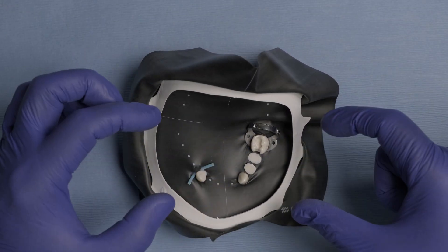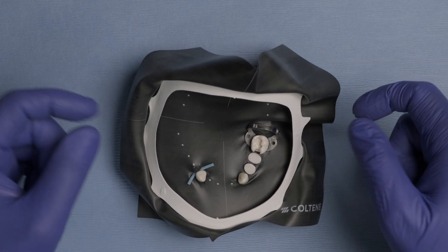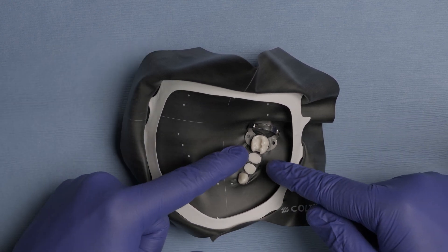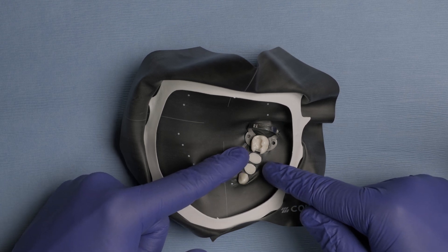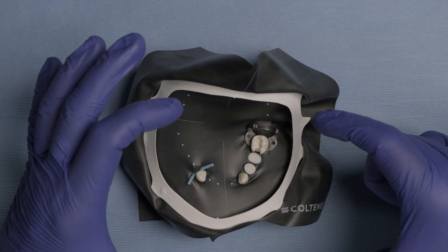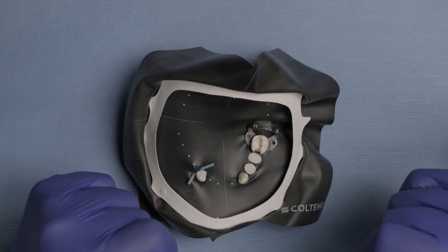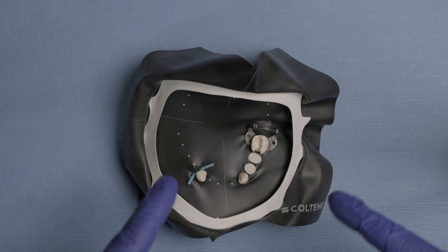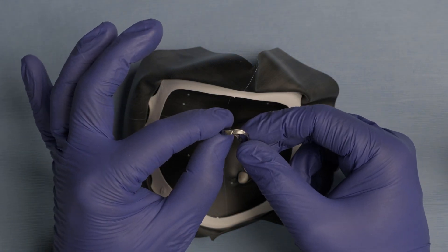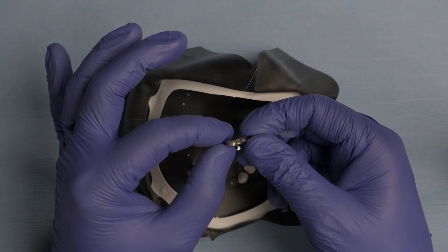We have our operative area correctly isolated using the isolate black rubber dam, a W3 clamp, and a wedget. Even though tooth number 20 and 21 are literally broken down to the gingival margin, this latex rubber dam has so much retraction potential that I was able, without an additional clamp, to isolate both teeth. However, I still need additional isolation because when building up teeth, doing a core buildup, or deep margin elevation, you'll most likely need additional retraction — and this is when the B4 clamp from the Brinker kit by Coltene comes into play.